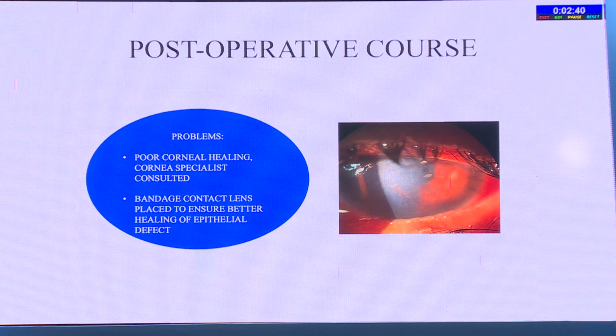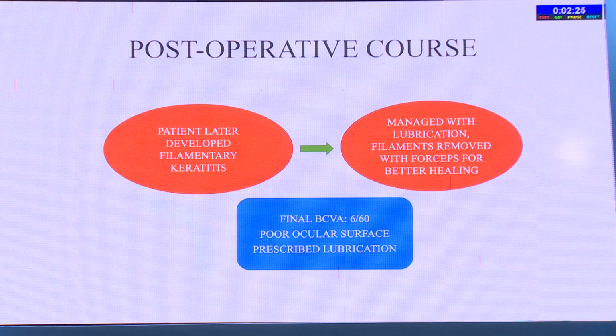Then there was a post-operative course. The patient had problems with poor corneal healing, so a cornea specialist was consulted, and we had to place a bandage contact lens in that patient to ensure better healing of the epithelial defect.